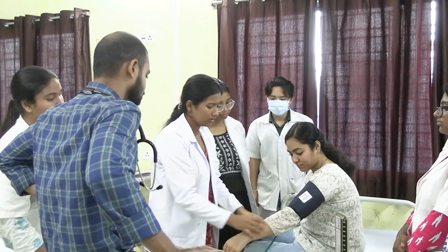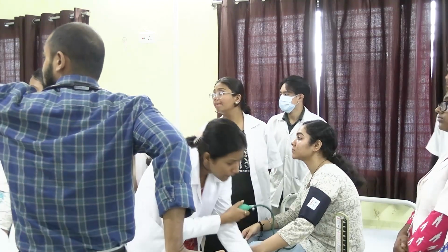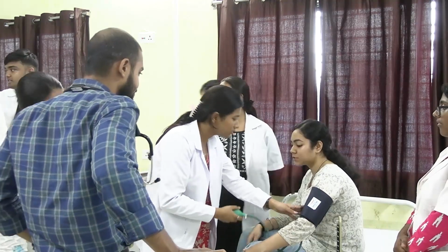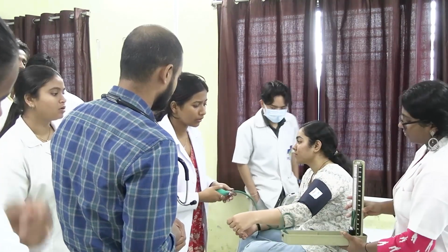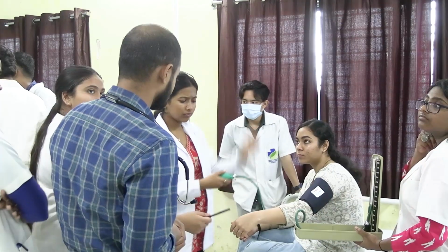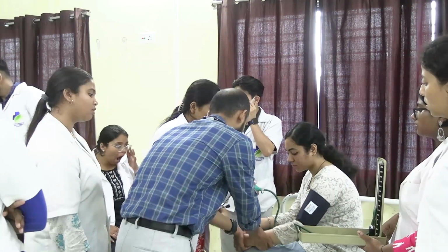Now what will you do? You guys can also practice. There are machines, bring one from there. Sir, the hand should not rest anywhere. It should be relaxed. The knees should be flexed, like this.